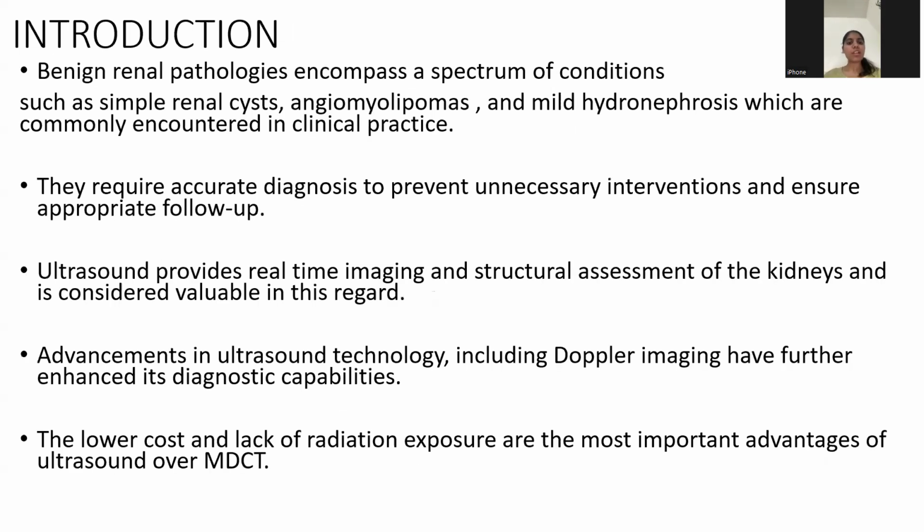Now, coming to the introduction, benign renal pathologies encompass a spectrum of conditions such as the simple renal cyst, complex cysts, angiomyolipoma, and hydronephrosis due to renal calculi, which are commonly encountered in clinical practice. They require accurate diagnosis to prevent unnecessary interventions and assure appropriate follow-up.